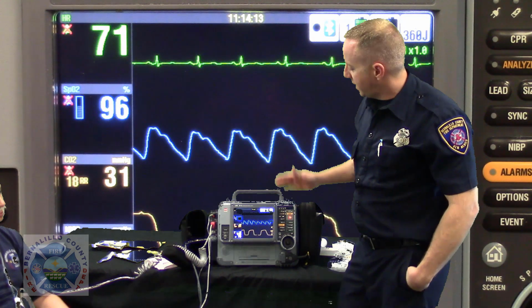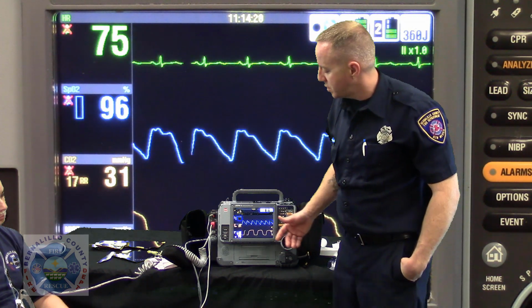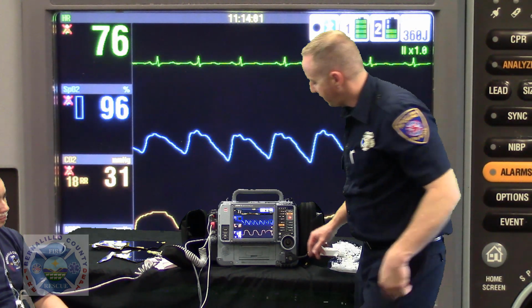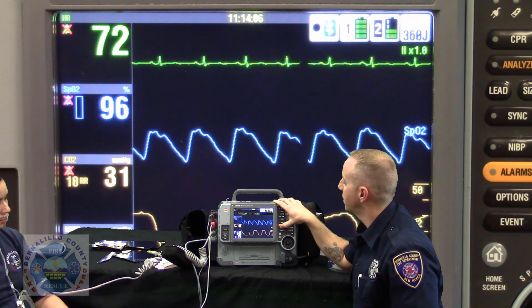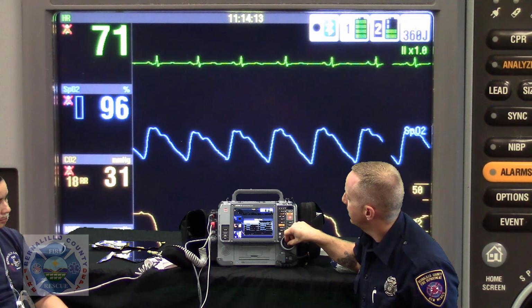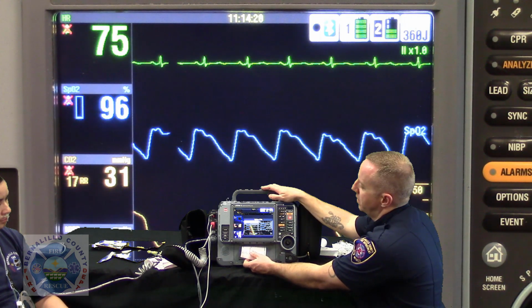So now we have an entire set of objective vital signs for our patient's initial clinical picture with a heart rate, sat, respiratory rate, end tidal, and a BP. And if I want to share this information with the person conducting the clinical interview without interrupting their interview and hollering out vital signs, I can simply just hit Options, Print, tell it that I'd like to print my vital signs, and pay that out.